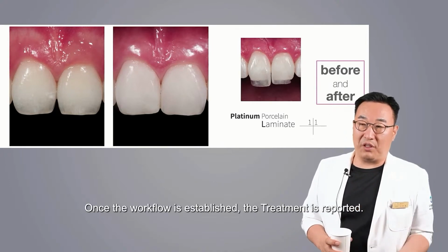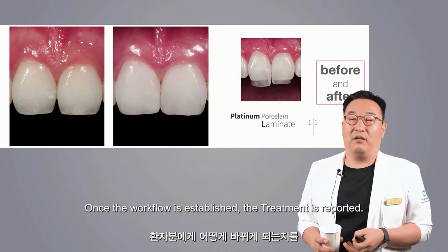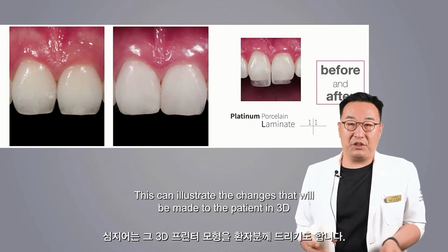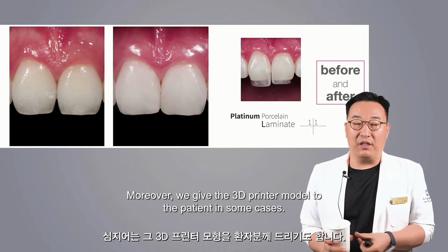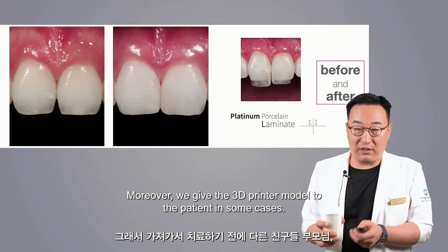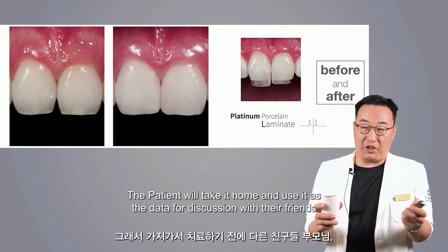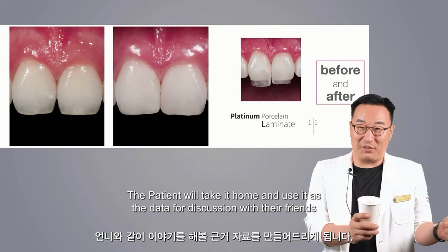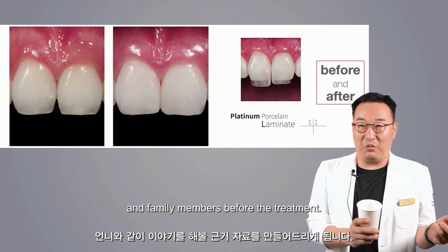Once the workflow is established, the treatment is reported. This can illustrate the changes that will be made to the patient in 3D. Moreover, we give the 3D printer model to the patient in some cases. The patient will take it home and use it as the data for discussion with their friends and family members before the treatment.